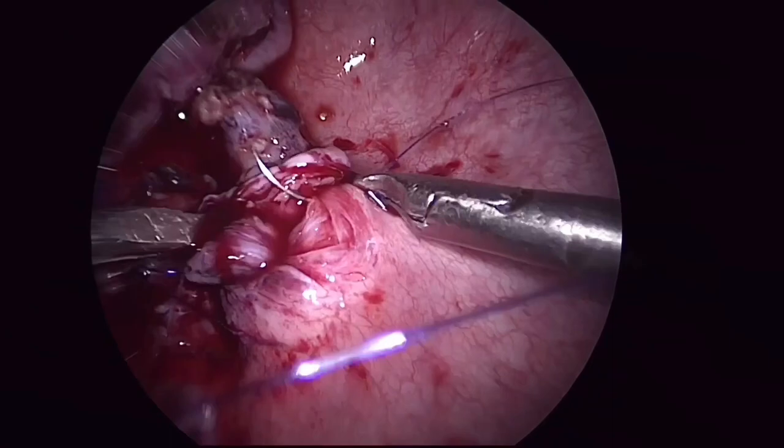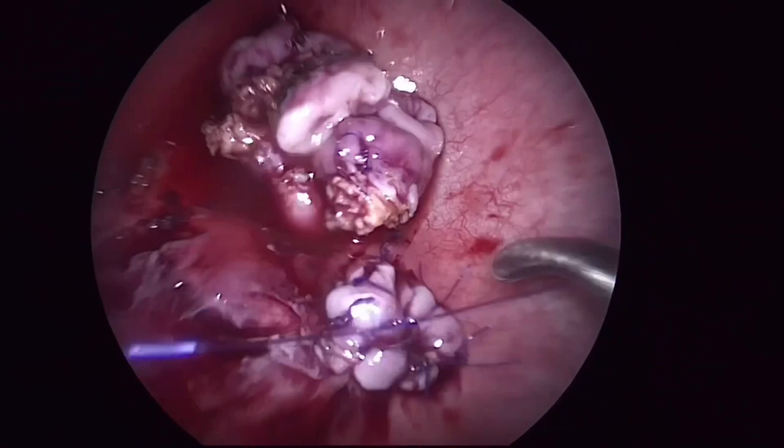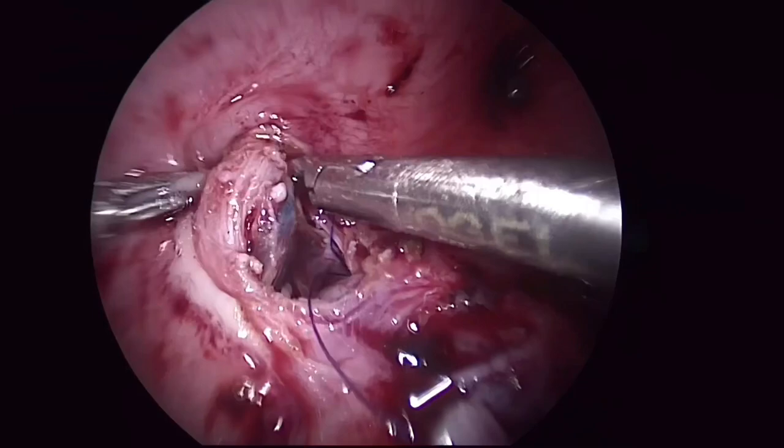The first anchoring stitch is taken with the entire thickness of the bladder wall including the detrusor. After that, mucosa-to-mucosal anastomosis is done using 5-0 polydioxanone sutures. The detrusor over the left ureter is then closed in interrupted fashion.